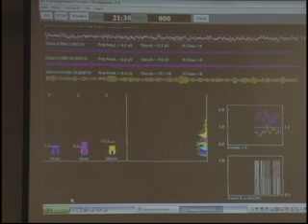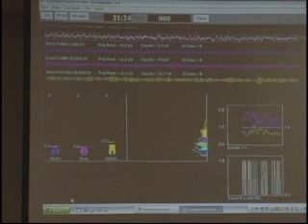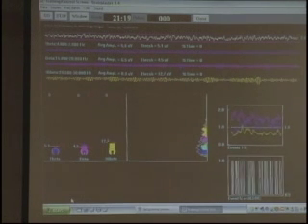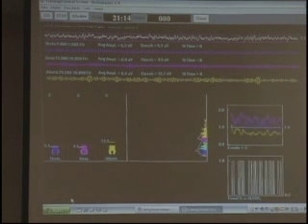So the B key changes the target, and Y will update thresholds at any time for all components with feedback based on them. Normally when you go to the next session, in one of your own protocols all that stuff would be saved — like text stats and everything — so you wouldn't have to do it over again. In your own protocol, you can preset that training screen to show up the same every time.